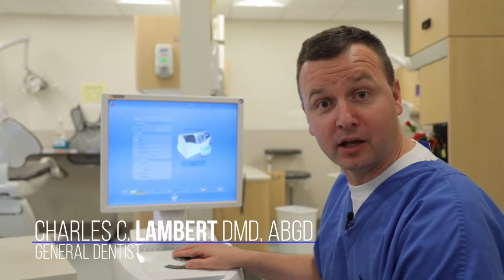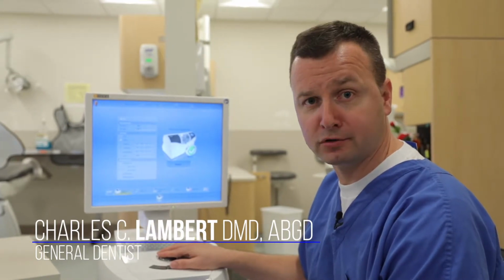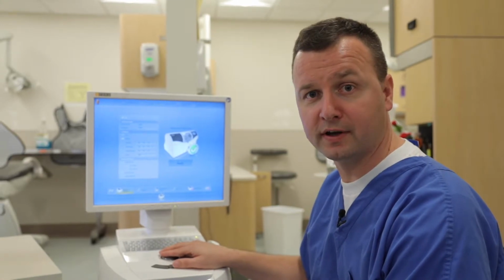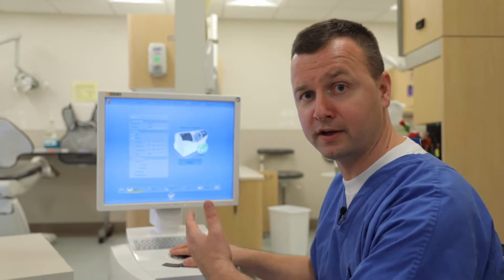Well, let me show you how to calibrate the MC XL. Pretty simple procedure. I'll show you the steps. If you do it regularly, your machine should stay in working order without too many glitches. So let's go ahead and show you that, and we'll go on the OmniCam.